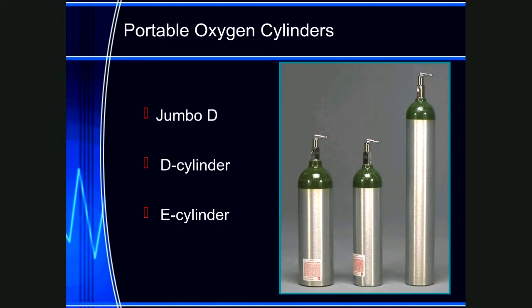Something to keep in mind: the safe residual pressure for an oxygen tank is 200 psi, which is the change out time. If the regulator gauge shows 200 psi, it's time to put a new oxygen bottle in there. One of the things we don't want to do is run oxygen bottles dry, because there's a couple reasons. One of the biggest reasons is condensation that can build up in there because of the compressed air that's in there.